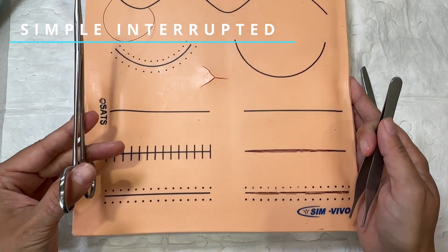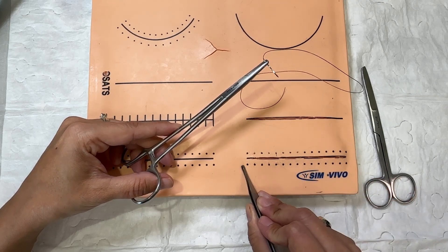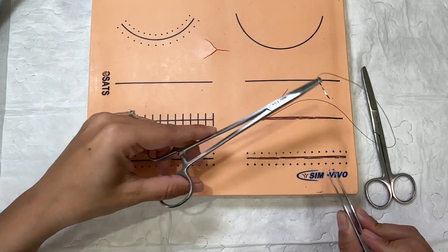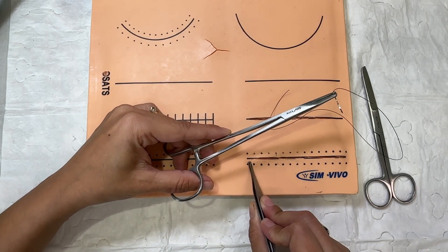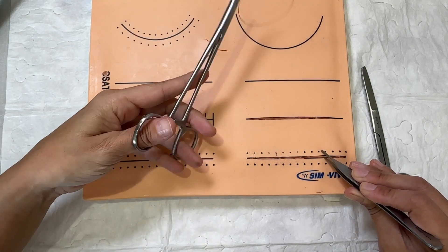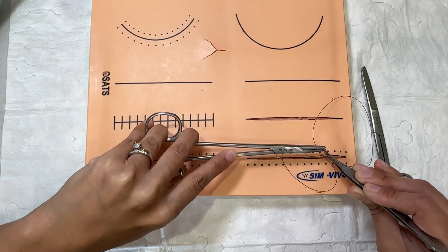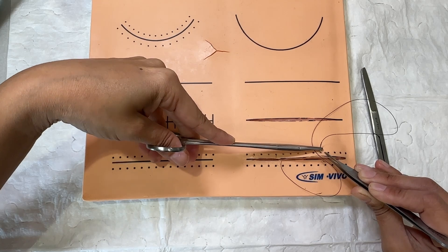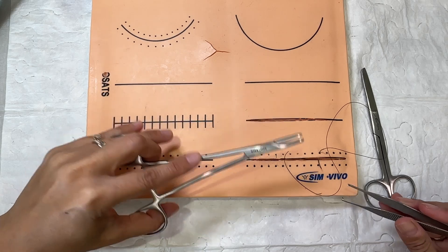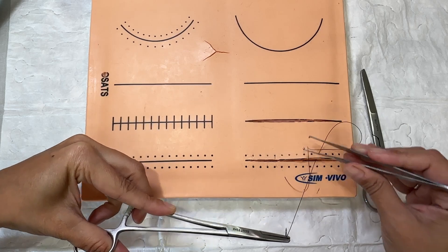When doing right-handed stitches, I usually start from left to right. Since I'm left-handed now, I'm going to start closer to this side and work my way over. First thing I'm going to do is grip the skin with my right hand, grab my needle driver, find this, insert it, and do a roll of the wrist towards me. As you're learning, it's good practice to disengage in between the wounds. Then I grab here and roll the wrist again to pull through the first side of the wound.